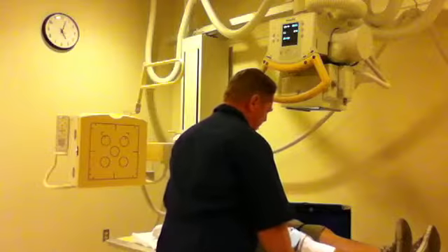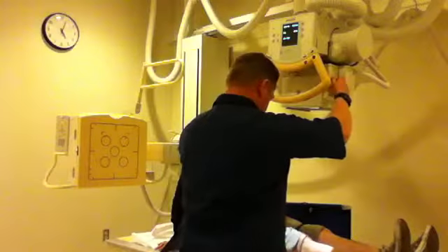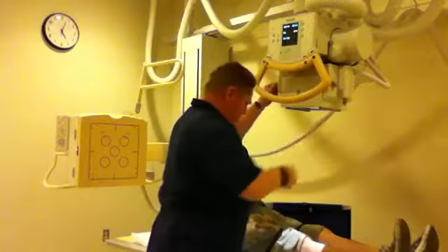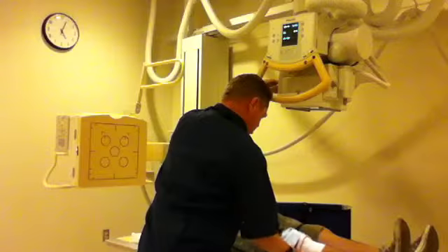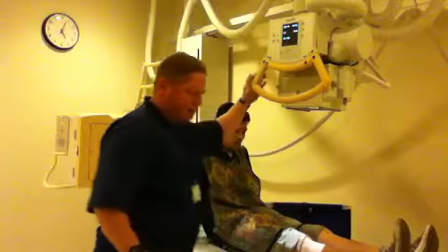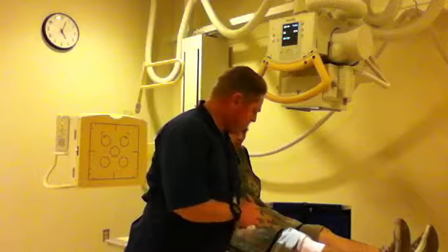This is the AP. I'm starting with the AP knee. I'm going to do this 60 at 3 for my technique.